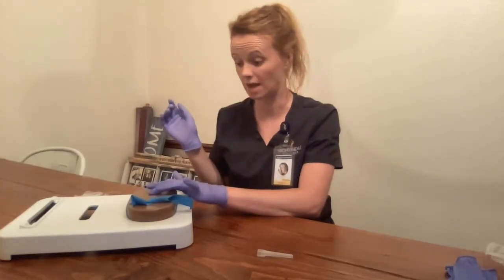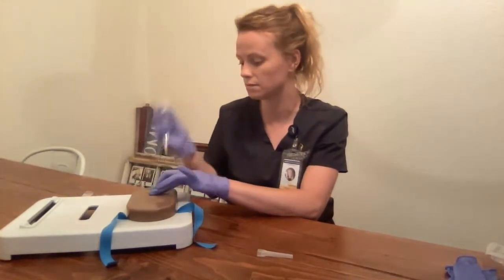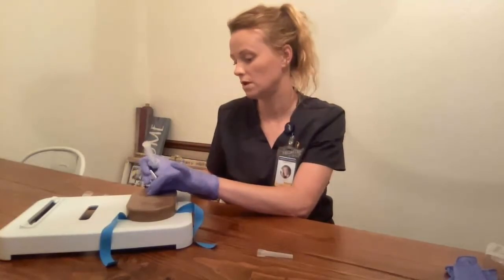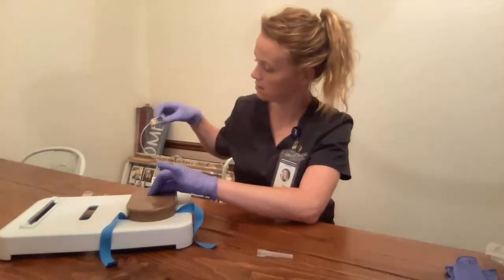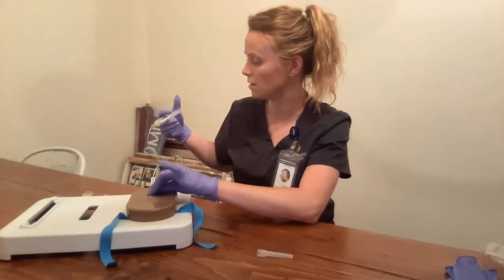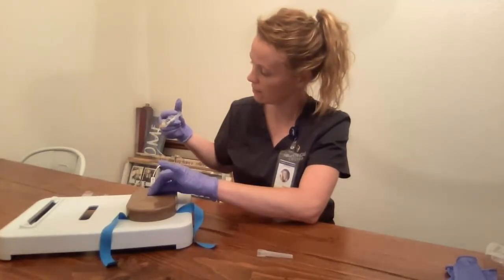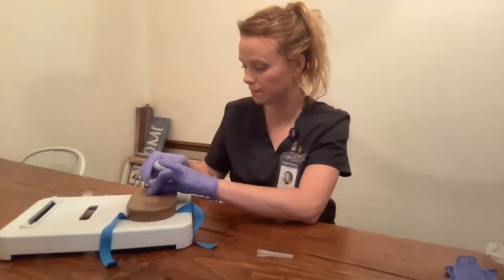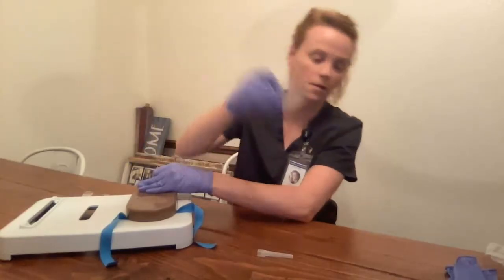It is in my sharps container. I have secured, or I am securing the IV here. I'm going to release the tourniquet. I'm going to get my saline and attach these two ends. Release the clamp. I want to draw back for blood return. I see blood return. I'm going to push the saline in slowly. Then I'm going to clamp the tubing.